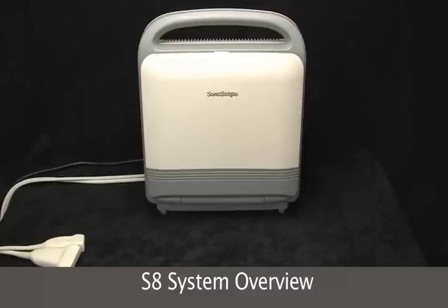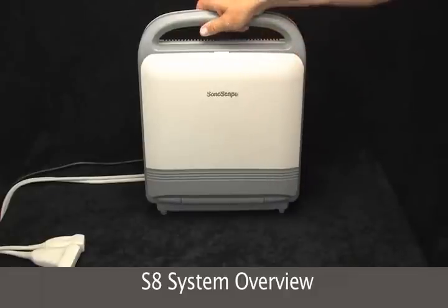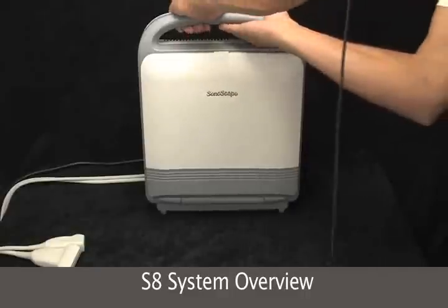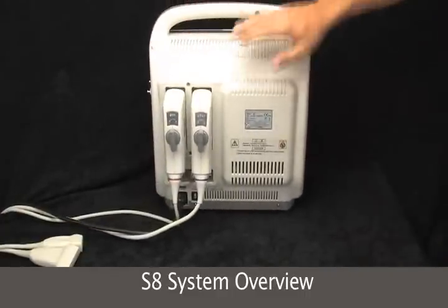This is the Sonoscape S8 ultrasound machine. As you can see, it's very small and it has a tiltable flat screen on the front, a big handle up top, and two transducer ports.